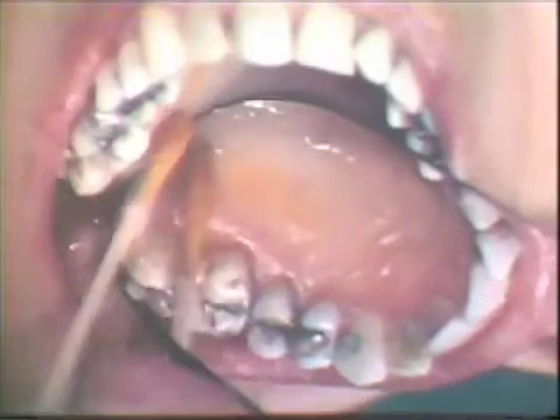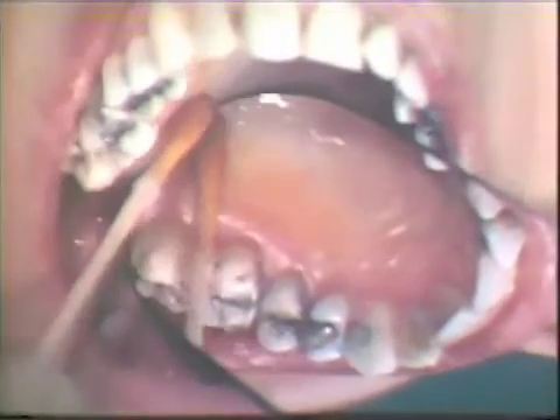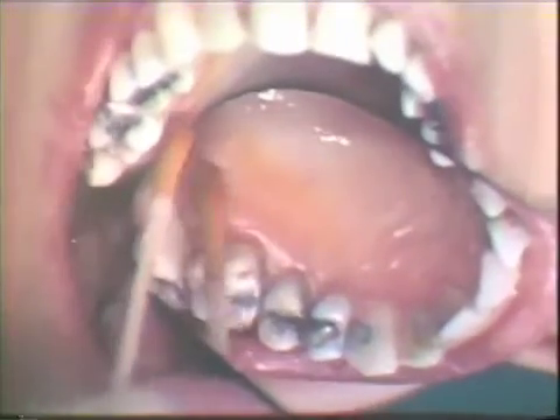The elimination of periodontal pockets at the distal surface of maxillary terminal molars is frequently complicated by the presence of bulbous fibrous tissue over the tuberosity. A distal wedge operation combined with reverse bevel flap surgery will be performed to eliminate periodontal pockets involving the maxillary second molar.